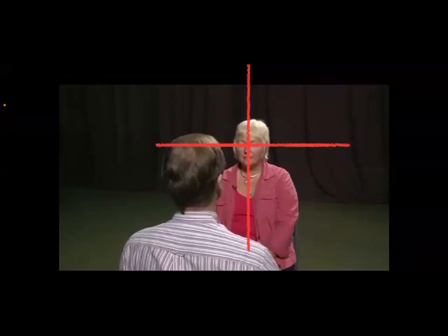I have done this procedure, doctor. So our diagnosis is proliferative diabetic retinopathy, and the patient already did laser therapy. I will expect to find this when I do the ophthalmoscopy examination.